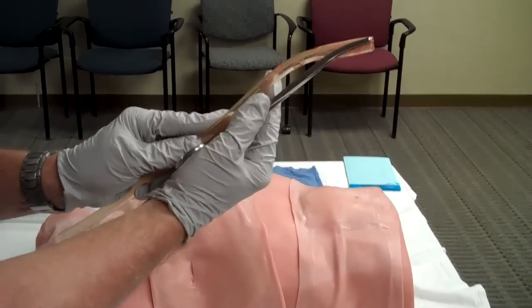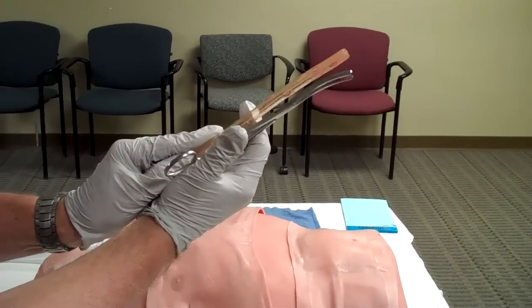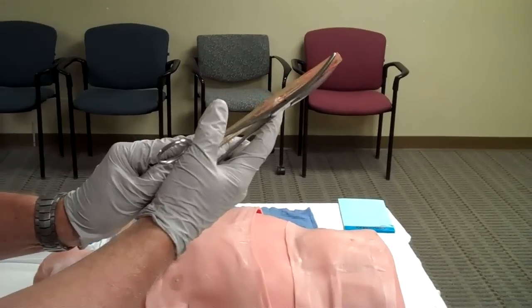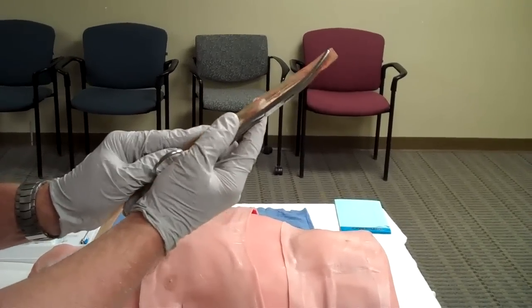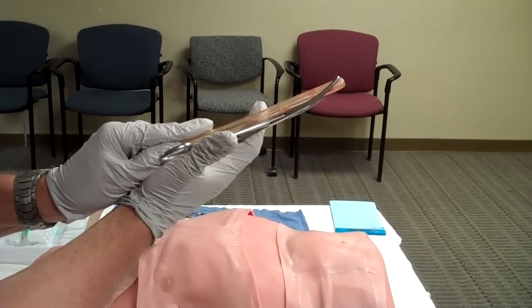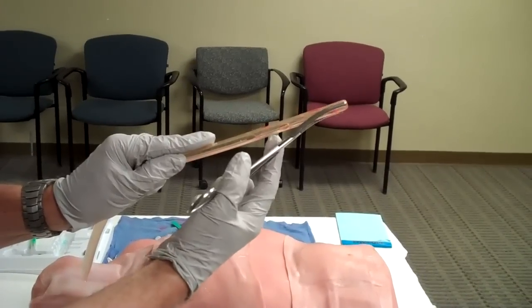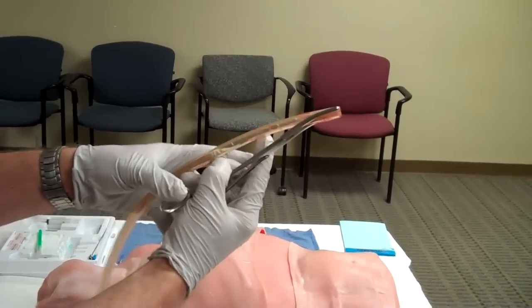Now, the reason I do that is so that when I release it inside the chest, it will actually pull out of the clamp. If I turn it around and do it this way, when I release it in the chest, it just kind of sits between the jaws of the clamp, and I can accidentally pull it out as I'm trying to pull my clamp out. So I will load the tube onto the back of the clamp.